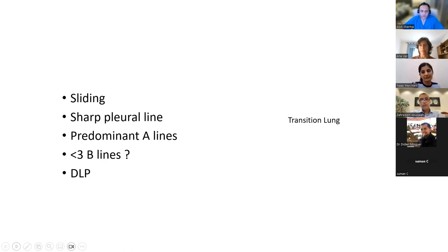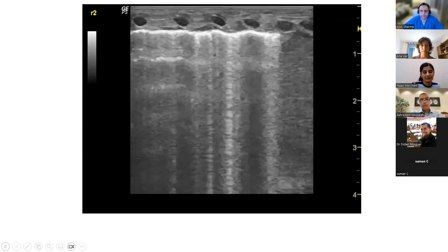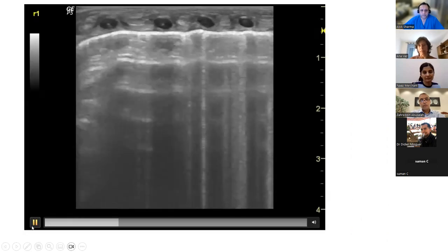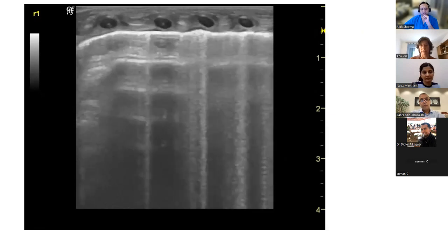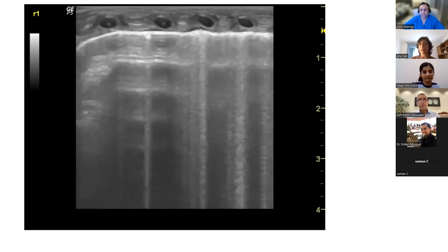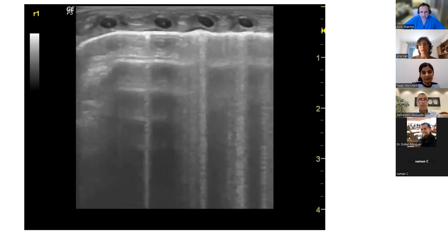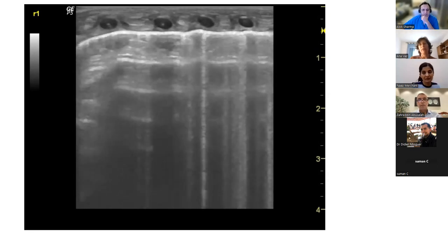I think your images are very good quality. If we just go back to your images, Anna. It's a very, very nice picture here, a very nice smooth pleural line with a great bat wing sign. But what is really beautiful about the image is that up to 4 centimeters, you've got really good depth penetration. What frequency are you using here? 12. Yeah. Even with that frequency, the gestation was 34, so 1,000 and a half grams.